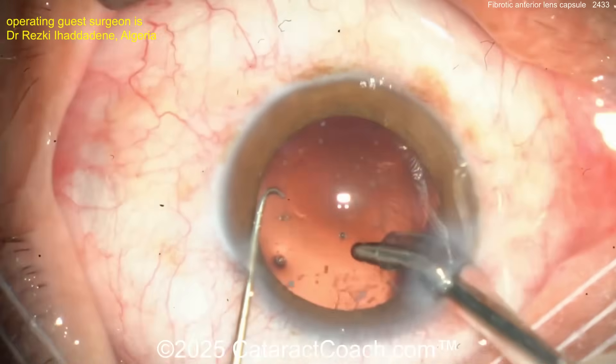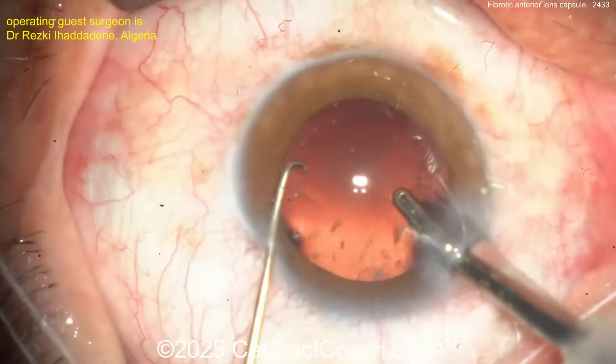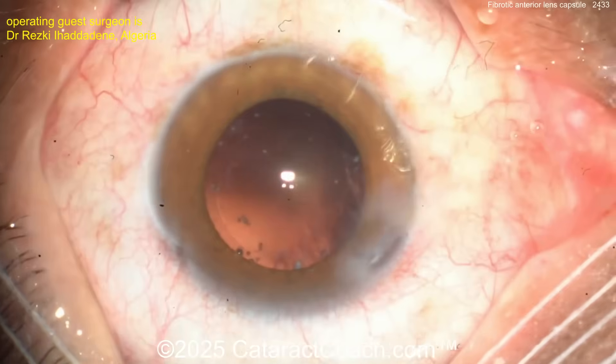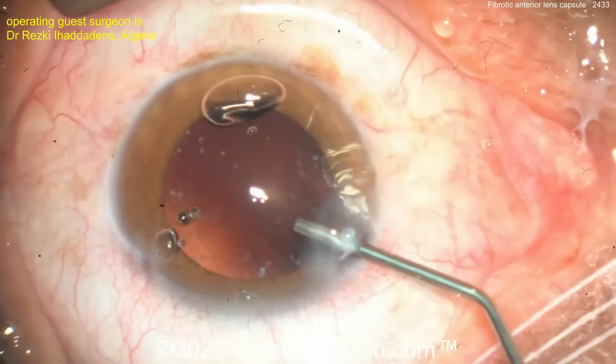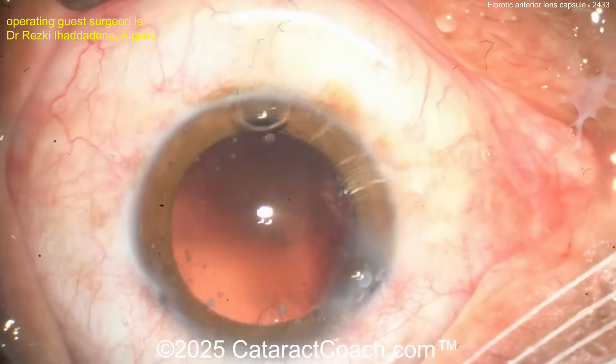Now going in with coaxial irrigation/aspiration to clean up. Very little cortex remaining in a brunescent lens like this. That looks fantastic — this patient is going to be amazed. The incision looks pretty good. In a dense case, be careful not to get a phaco wound burn.